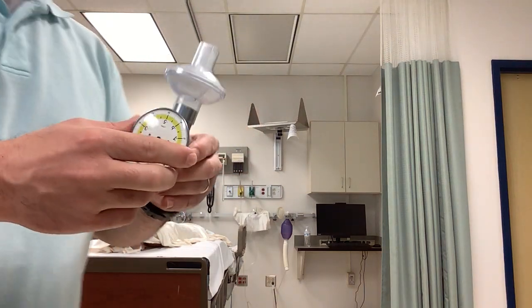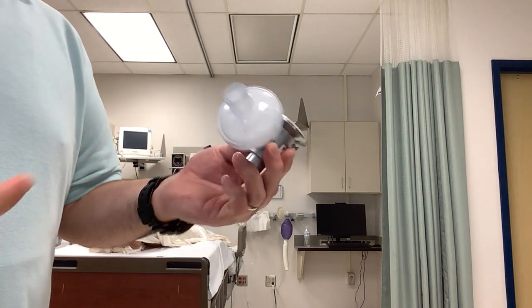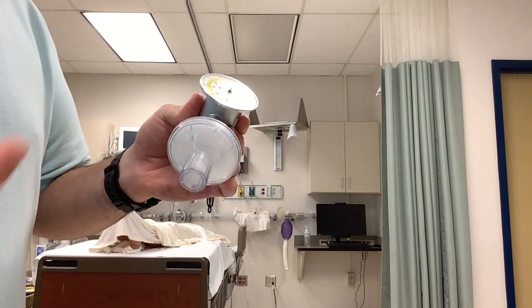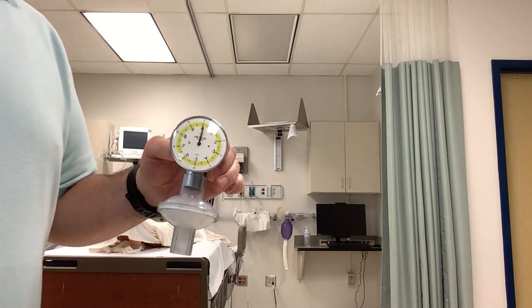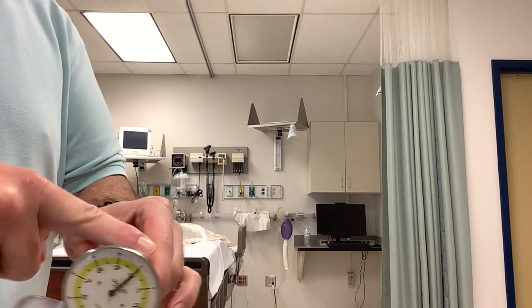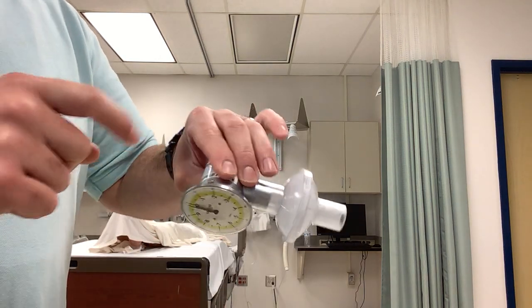As far as this one is concerned, I've got the bacteria filter placed where my mouthpiece would be, so that is going to be where the inspiratory flow goes in. Then you have expiratory flow that would come out this direction. And then ultimately, you've got a reset button here, and you've got an on and off switch on the side. So your on and off switch is here, and a reset button here.